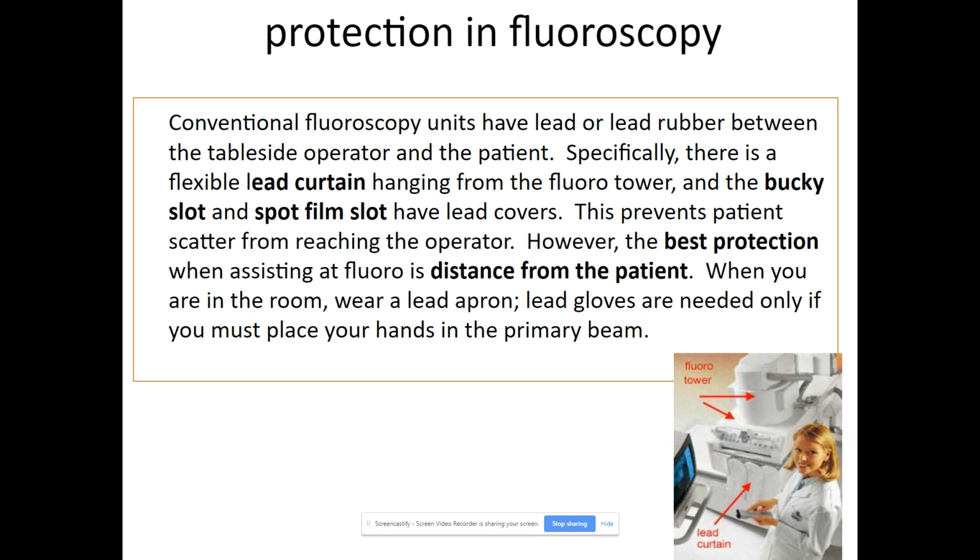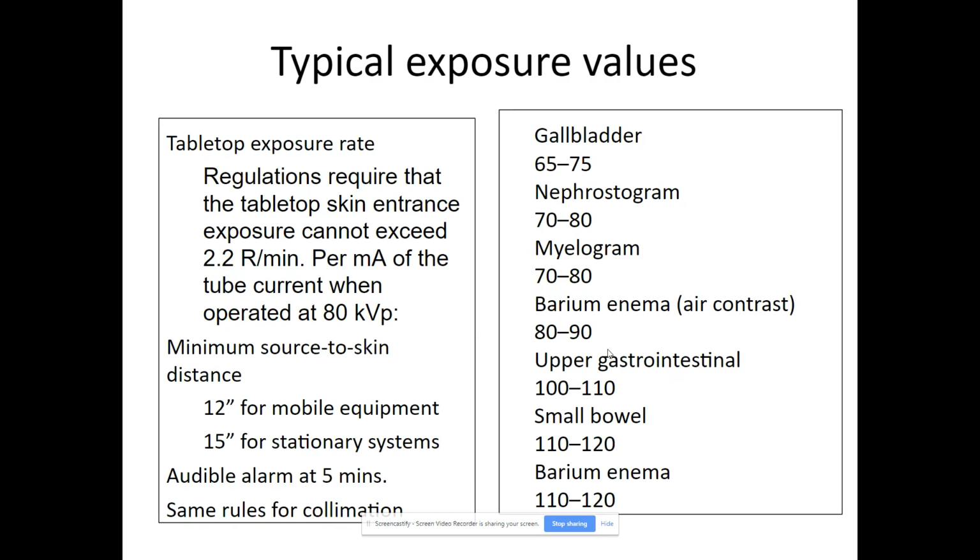And now, okay, where was I going with this? They don't even have to get as much radiation, including in angiographic procedures where it's just fluoro all day long, right? In the angiography suites, that's all they do all day. Is fluoro, fluoro, fluoro. There have been actual studies where radiologists that get brain cancer have cancer on the side closest to the tube more often than not. Yeah, crazy stuff. So we're almost done with this. Yay. Me too.